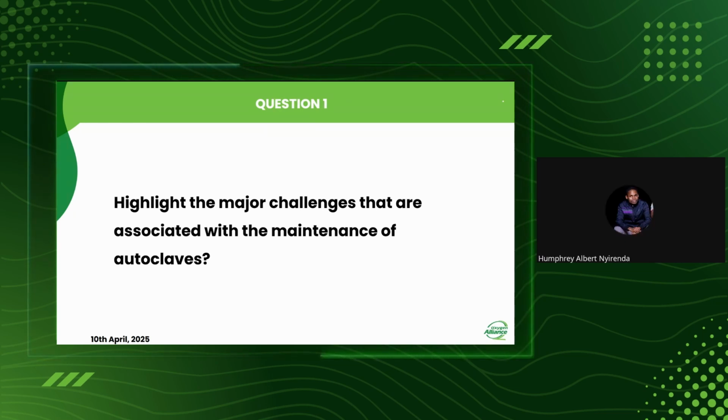Thank you very much. One of the challenges we usually face with the autoclave is what my colleague has mentioned about the heating elements. To answer the question, eventually those blown-out heating elements have to be replaced, but we also have to analyze the causative agent of the problem at hand. Like he has said, most of the cases encountered across Malawian hospitals is the burning out of elements.